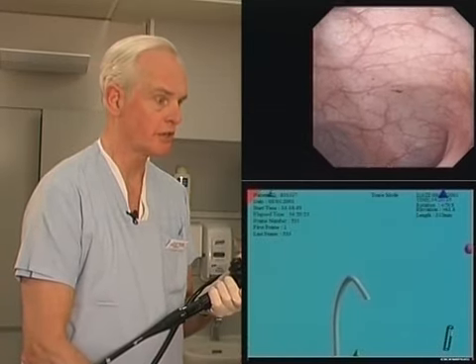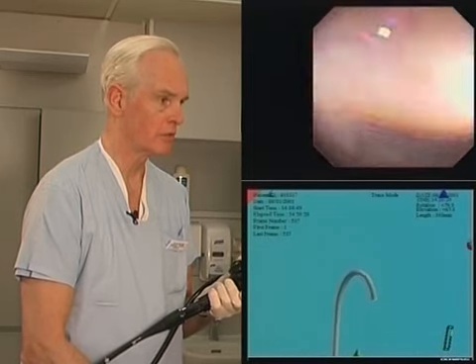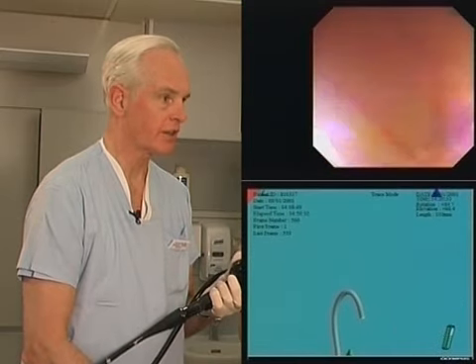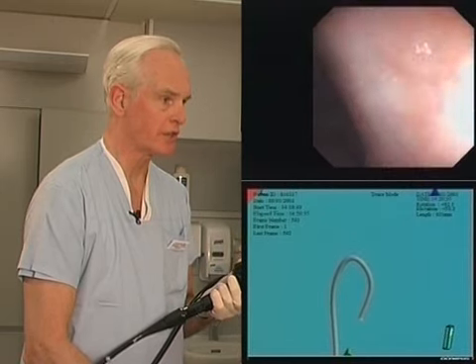For just teaching or audit purposes especially, scope guide can transform colonoscopy from a matter of guesswork and feel into a logical procedure, sometimes a much quicker and more comfortable one for the patient too.